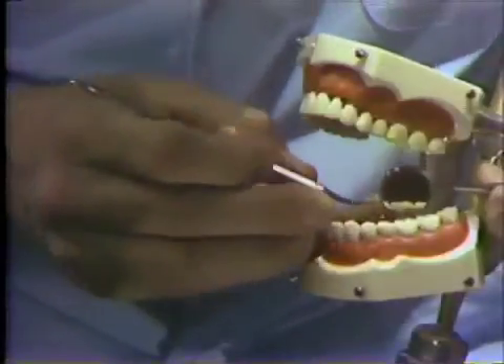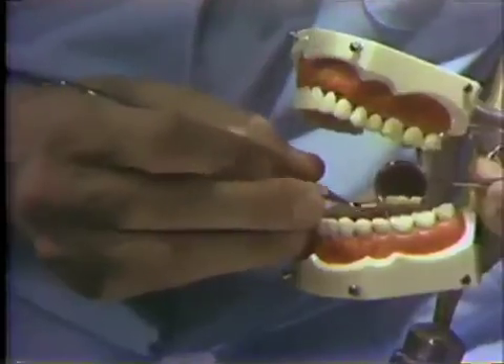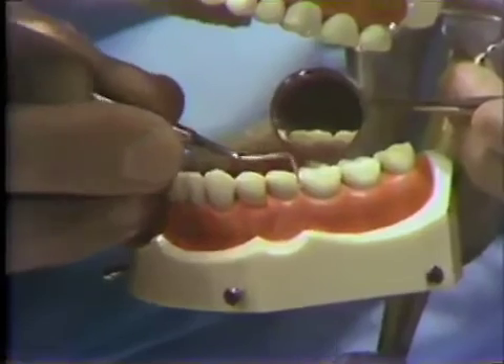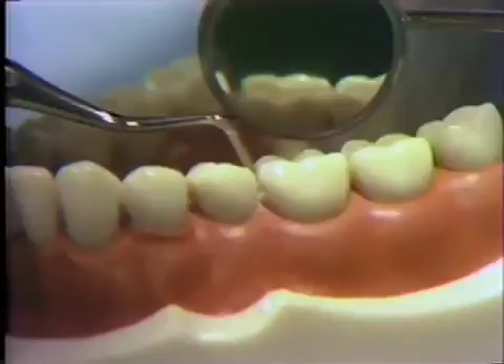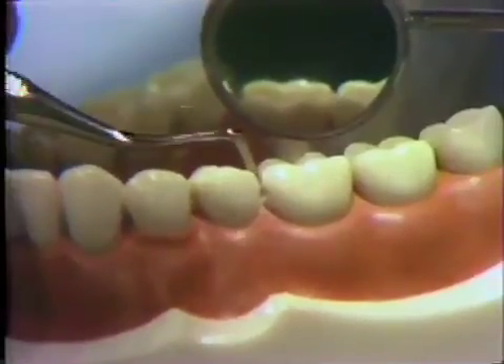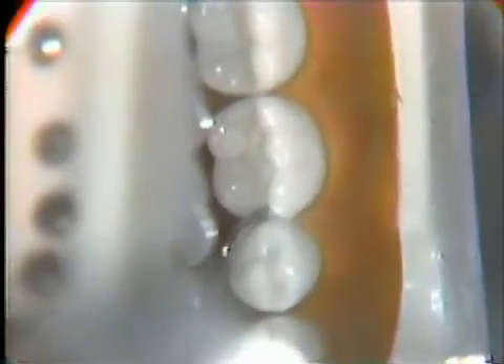Switching to the left of the pair and applying the instrument to the lingual proximal wall. Again, we are planing, removing extraneous rods, refining the wall as well as the line angles, extending across the floor into the cervical area.